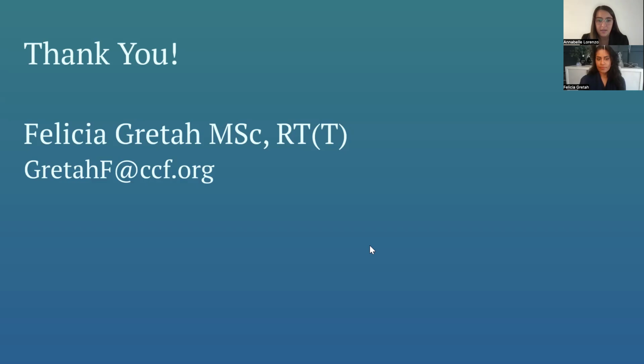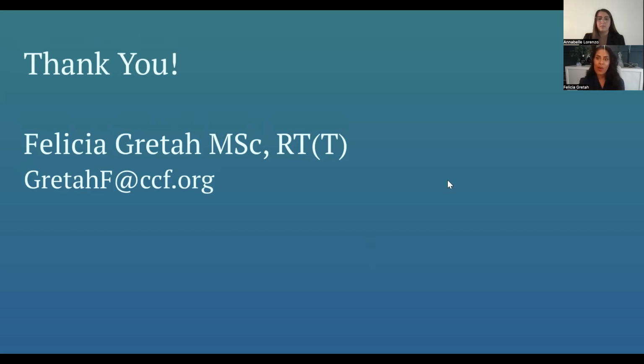Another question here. In addition to the minimum breath hold time of 15 to 20 seconds that you're required to identify suitable candidates, is there also a minimum number of breath holds? For example, does the patient need to be able to do at least 3 breath holds of 15 to 20 seconds? Yes, so that's good. At the time of sim, this is also something that we've worked on. Instead of just doing those 3 test breaths, we actually have the patient do up to 15 because that really is more indicative of what will happen when the treatment happens. And we want them to be prepared for that process.